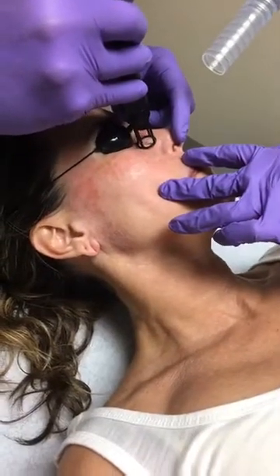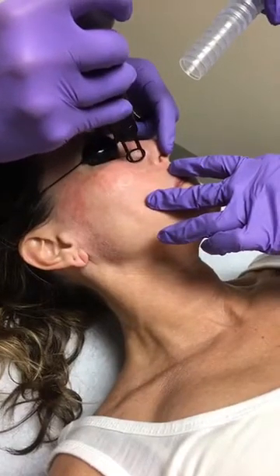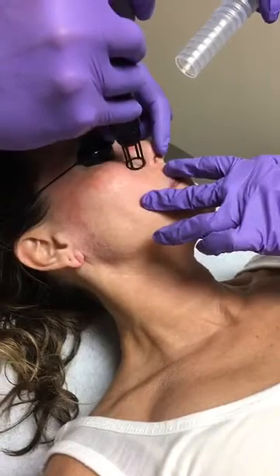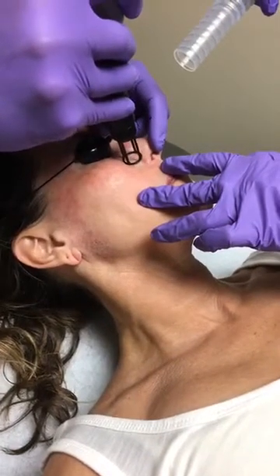We also treat unwanted tattoos, hair removal, and we have an acne setting on our IPL which works great in terms of helping control some of the outbreaks — great with cystic acne.